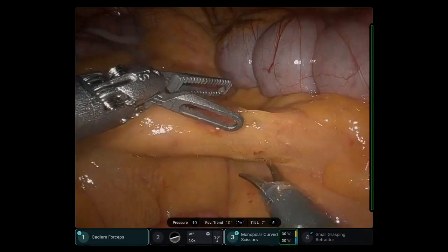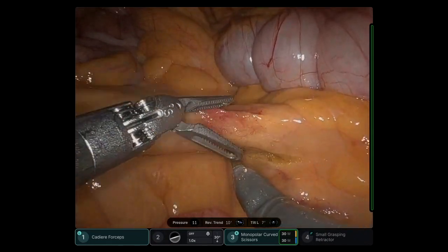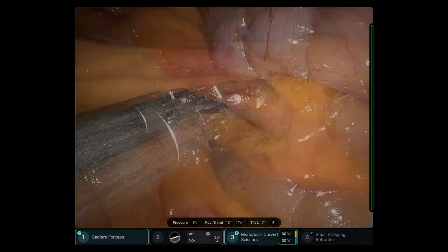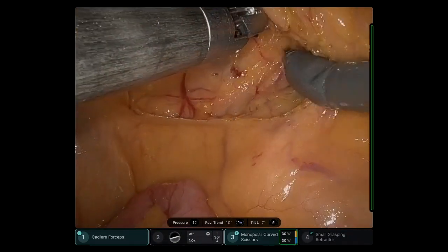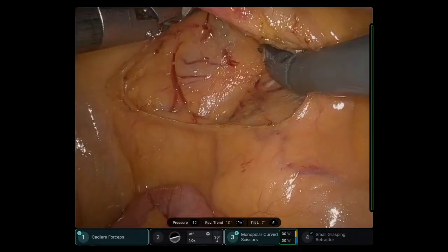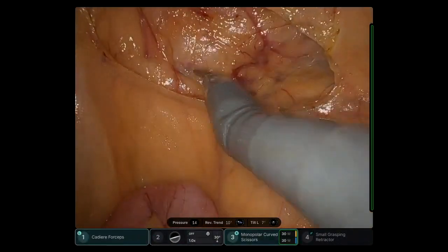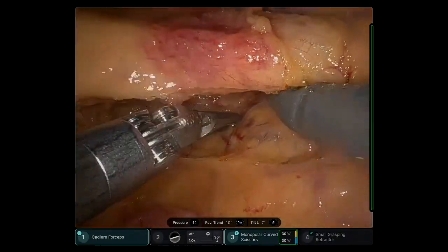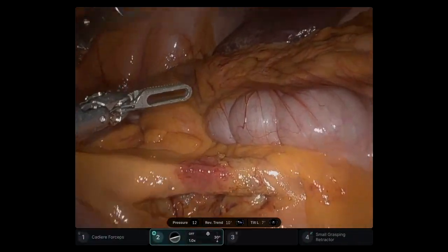Here I'm using the electrocautery scissors to make an incision over the peritoneum of the iliocolonic pedicle so I can enter the retroperitoneum. The amount of energy was very easy to modify at the robotic console. I did not need a nurse or anyone switching the energy bedside, which facilitated the efficiency of the tasks.